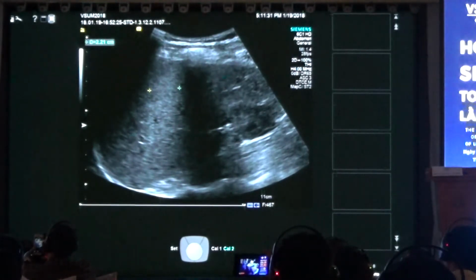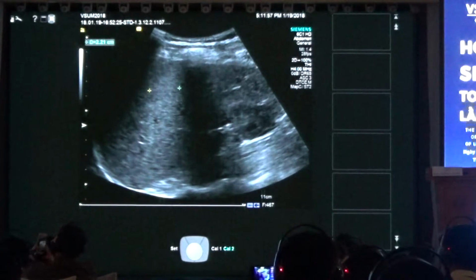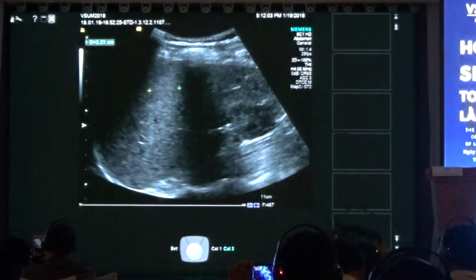To be like a cat on one side, to get a curved thorax, we wish to widen the intercostal space. And now I'm doing everything to widen the intercostal space. Bring down this one. Normally the patient is doing like that with the right arm, but I will take a little bit more movements like that. He's a very friendly patient, and many patients in this position do not know what I'm doing.